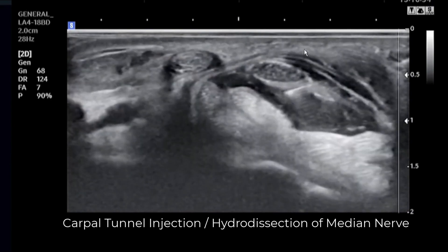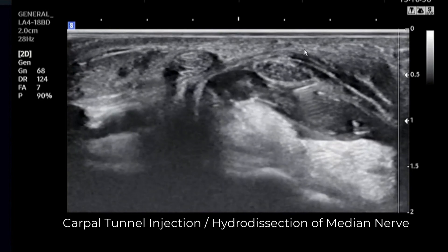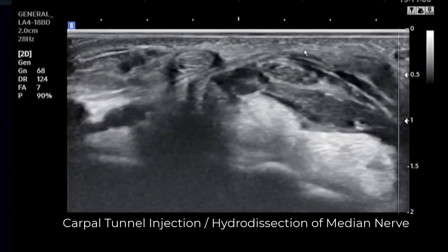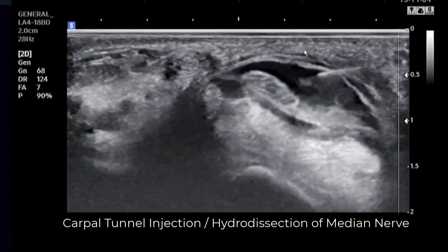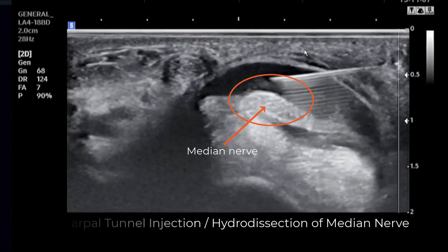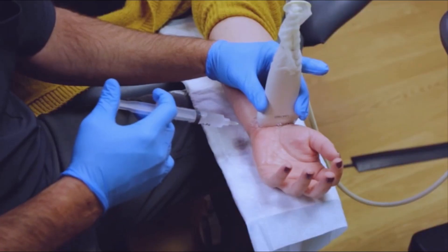This technique is preferred over the more traditional and antiquated method of poke, push, and pray as most continue to do. The difference is that the ultrasound allows providers to see and target the specific nerve that is the problem. Using ultrasound guidance allows for a precise administration of medicine to the tissues needing it, and can potentially decrease risk to surrounding tissues.